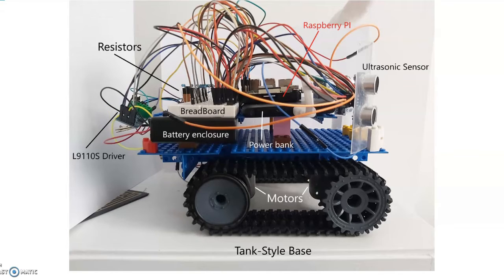A Raspberry Pi computer was selected to act as the brain to implement the learning algorithm and to run the necessary code to check the distances and move the device. To avoid any soldering, a breadboard was implemented to serve as the intermediate connection between all the components, the sensors, the resistors, and the Raspberry Pi.